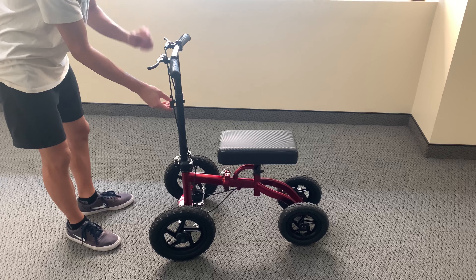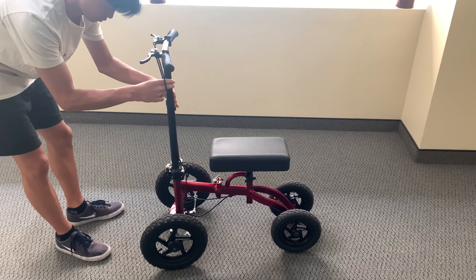It includes an adjustable knee and handle height that works for patients of all sizes.